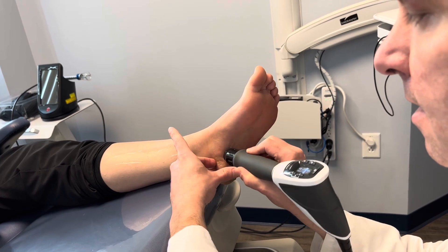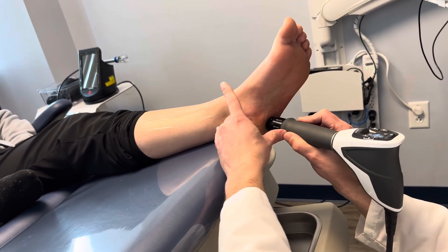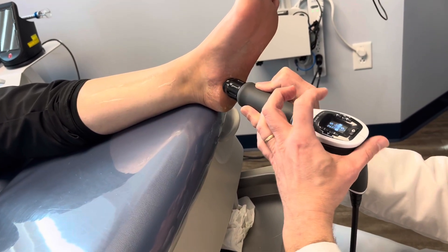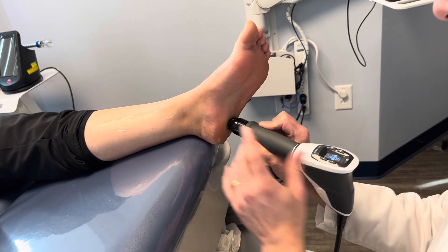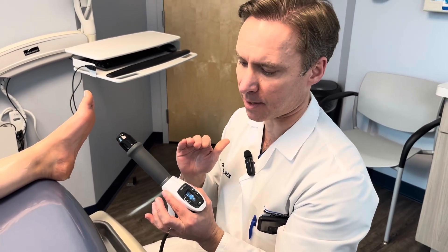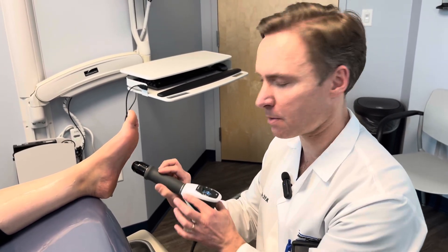You push more pressure on the heel and reduce it in the arch. I'll increase it and try to get it up to at least 2.5 bars. If they have pain, they'll let me know. The pain level should be about a 5 or a 6 — it shouldn't go beyond that. For soft tissue like the plantar fascia, respect the soft tissue: 2.5 to 3 bars is all you need. For bone penetration, you might have to go higher. If I'm doing a combo of radial and focused, I'll do 1500 pulses; if just radial, I'll do 2500 pulses.